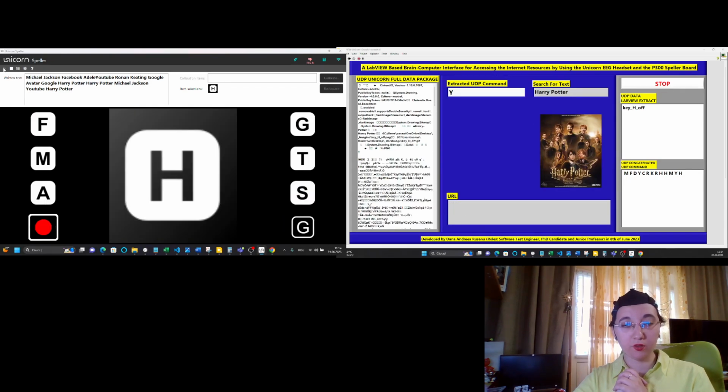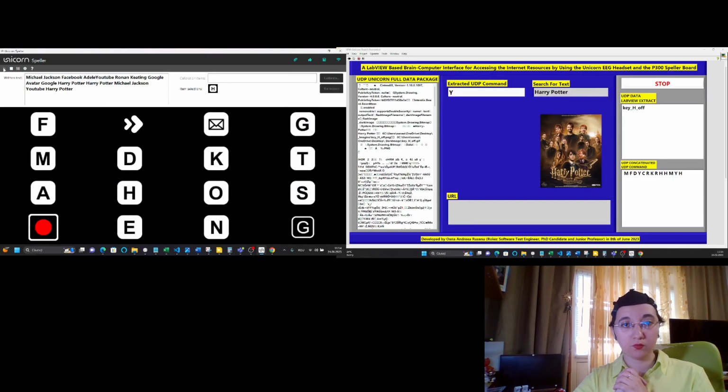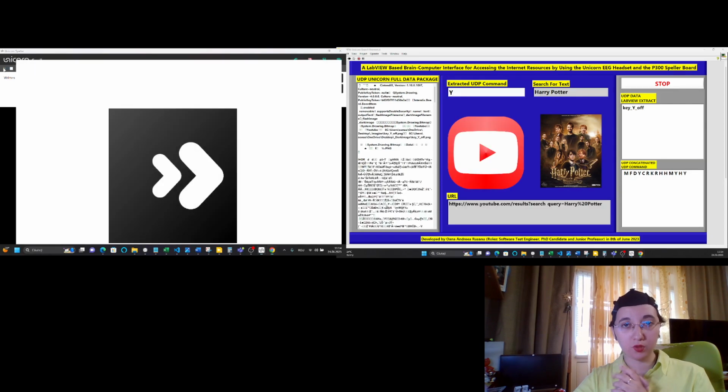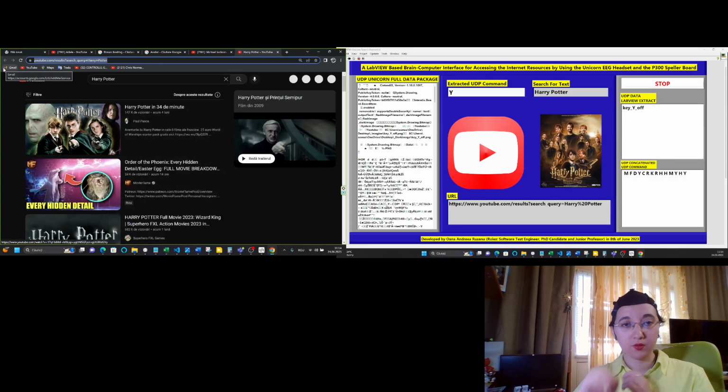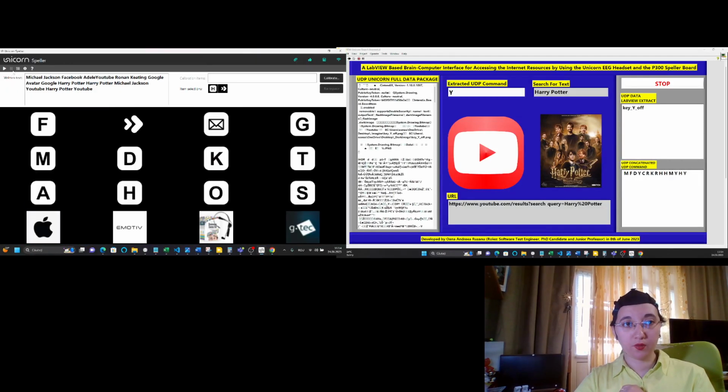Harry Potter correctly selected and now the YouTube. The YouTube is correctly selected, so now it's just perfect. You can see the related content opening.